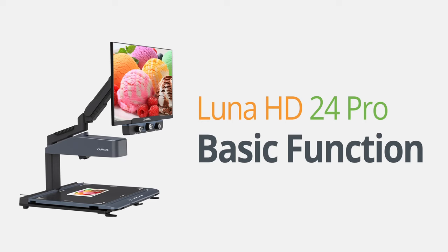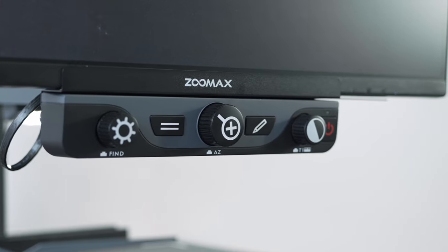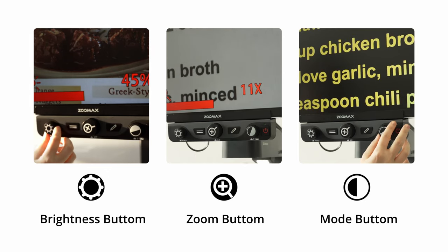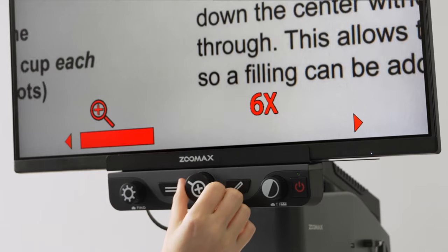Let's begin in basic mode. The brightness button, magnification button, and mode button are all easily adjustable. These thumb-size tactile buttons are placed beneath the video screen. Turn the magnification dial to zoom in or zoom out to your comfort level.